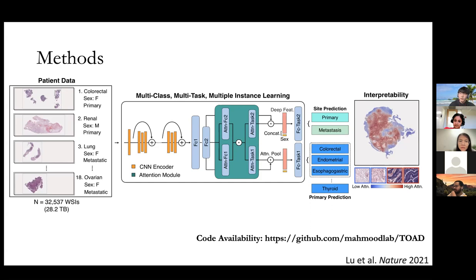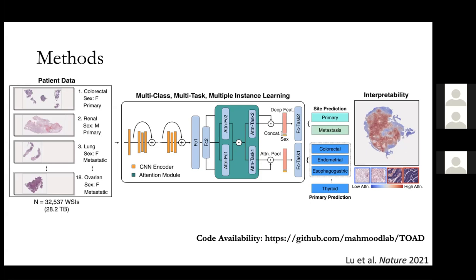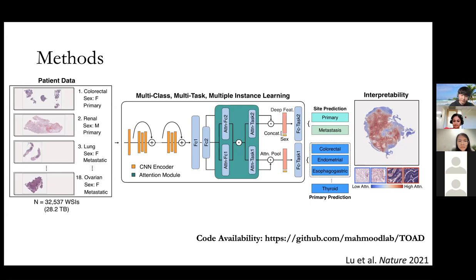Yeah, so there are two ways we tried to validate it. One way was that we used the instance level classifier that assigns a cluster at the patch level. We randomly sampled patches from each slide and passed them through that classifier to do the clustering. Then we went back and extracted those patches and visualized them: are they actually representative of the different classes? Do they capture the morphology of the different classes? It's not perfect, but we found that it does quite well. When we get those patches and their embeddings and visualize them, I believe with PCA, you can see that they divide the feature space. And if you visualize the different clusters, they correspond to different morphologies. So that's one way we visually analyzed it.